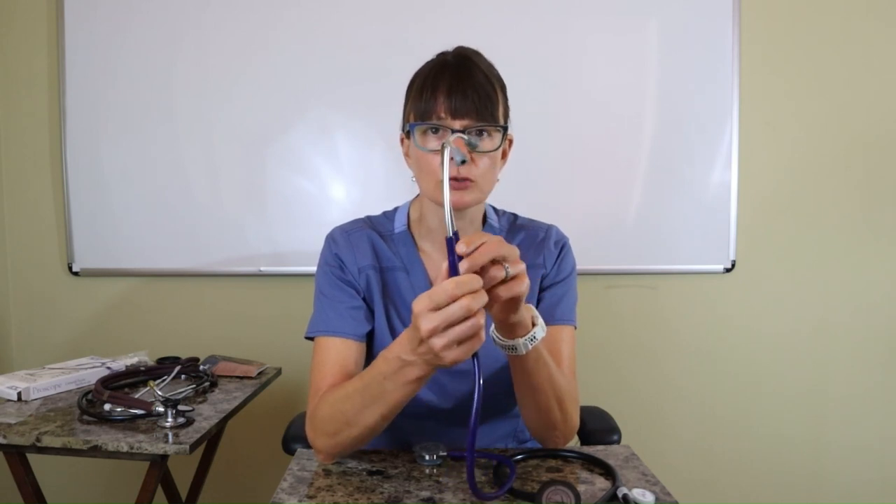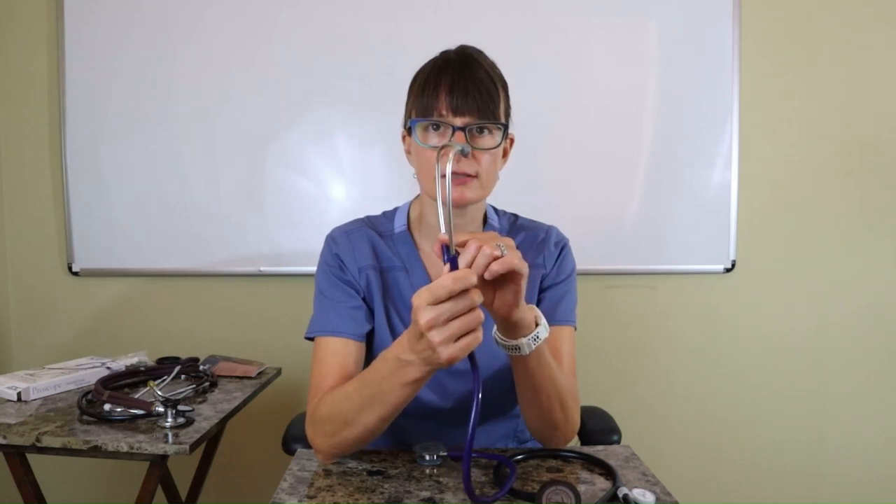Keep in mind that the stethoscope earpieces — the metal parts — are always at an angle and go in like this. Make sure that you use it correctly, and if it's a good fit, it will completely seal your ear canal so you can just focus on your patient.